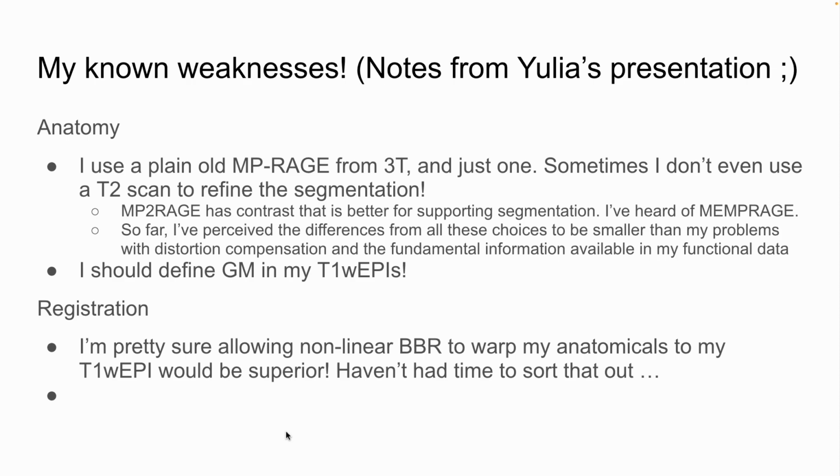So everyone get on the phone to NIH, hint, hint, and bring us a boundary-based registration algorithm in AFNI. Otherwise, I can pipeline it out into a different software. But to answer these questions about why do you use AFNI as opposed to other ones, exquisite documentation, so very scriptable, really accessible. You know exactly what's happening to your data at every step. And so I'm kind of attached that way.